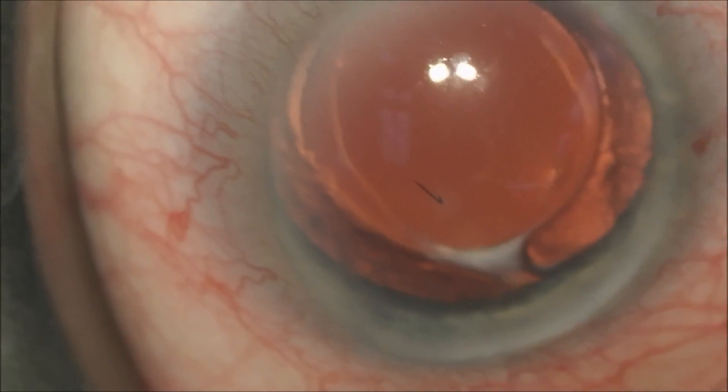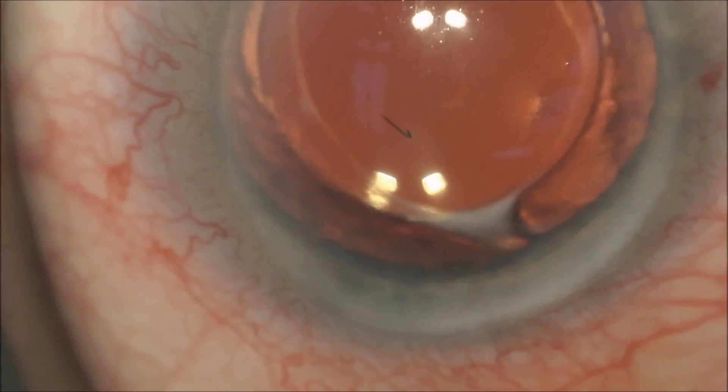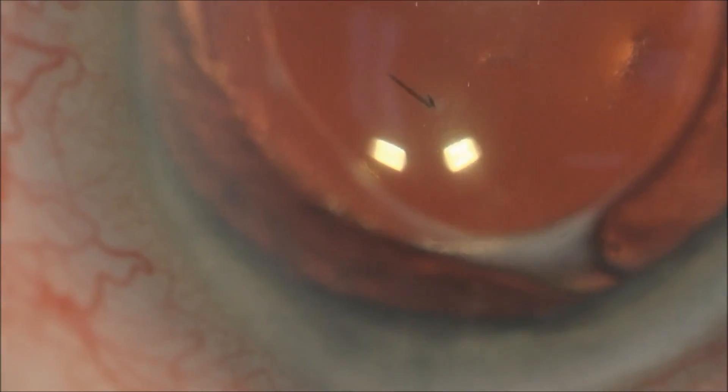You can see he has an intraocular lens implant — this happens to be a toric lens implant that corrects patients with astigmatism — and you can see the bee stinger in through the cornea to a depth of approximately two-thirds of the anterior chamber.